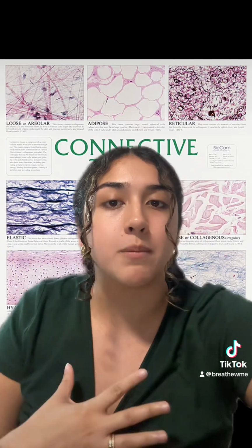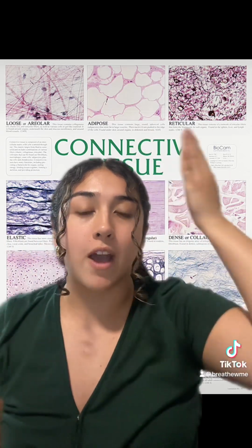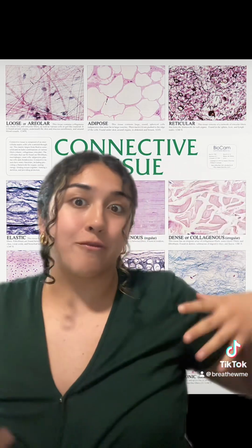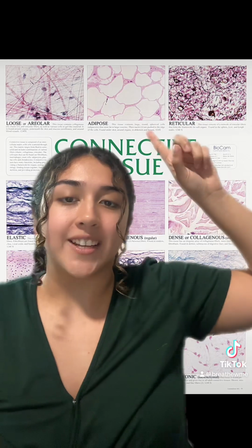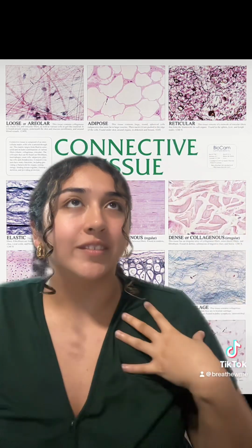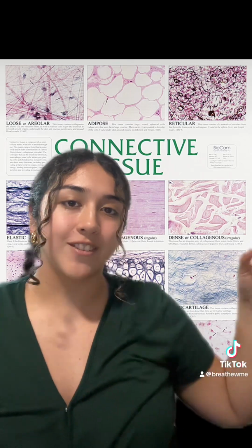I'm in your anatomy lab class, and we're going to start with loose areolar tissue. It is called loose areolar tissue because of its loose-looking structure of fibers and cells, which is found throughout the body. Here, of course, we have adipose tissue, otherwise known as fat. Our fat cells make me chunky, right? And this is great for things like insulation. That way I don't get cold as easily as everyone else, right?